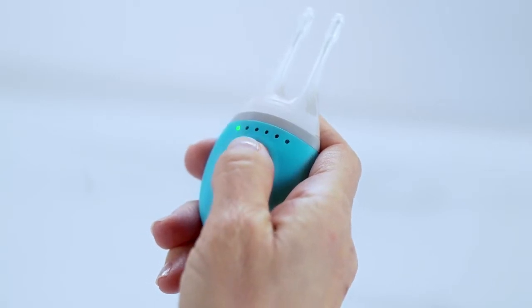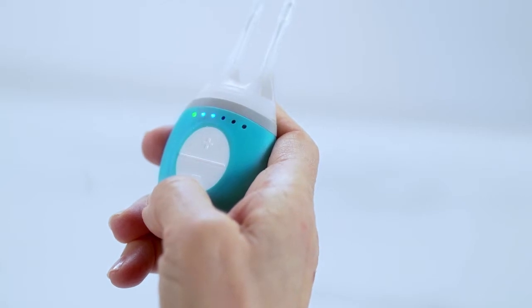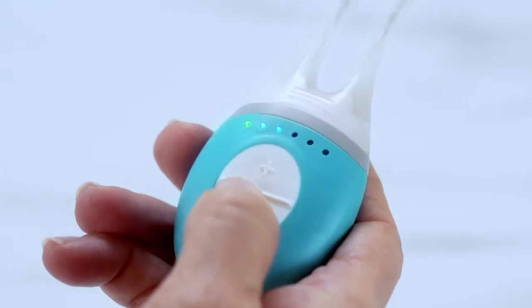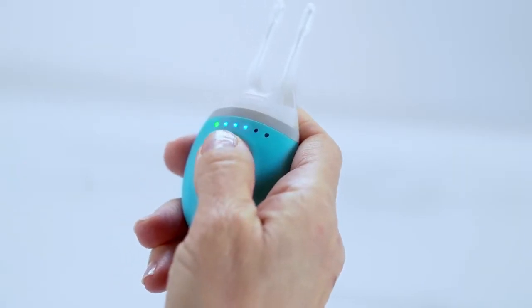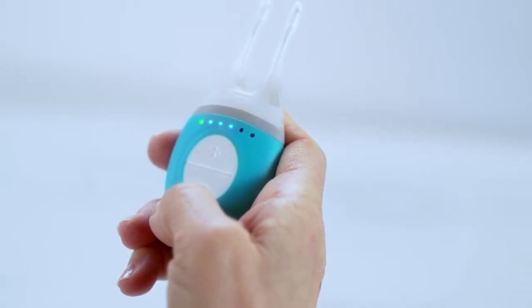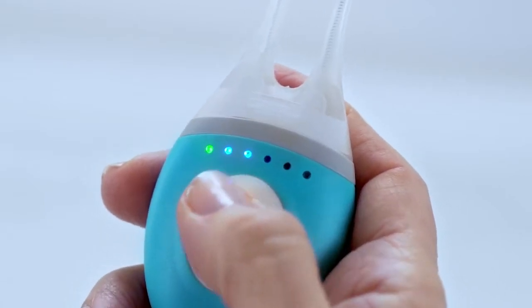TrueTear has five levels of intensity that you can select from by pressing the plus and minus buttons. Each press of the plus button will increase your strength level by one, and each press of the minus button will decrease your strength by one. The base unit will briefly vibrate when either button is pressed, and blue lights will indicate what level you've selected. If it's your first time, start with level two.